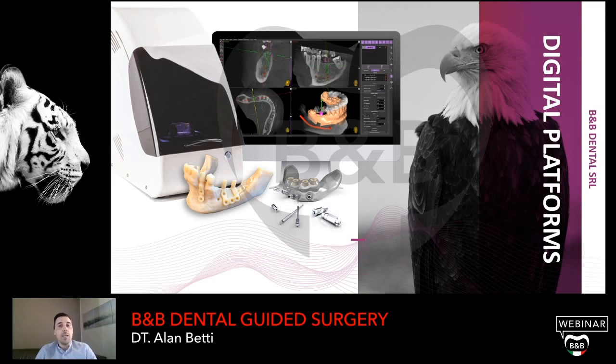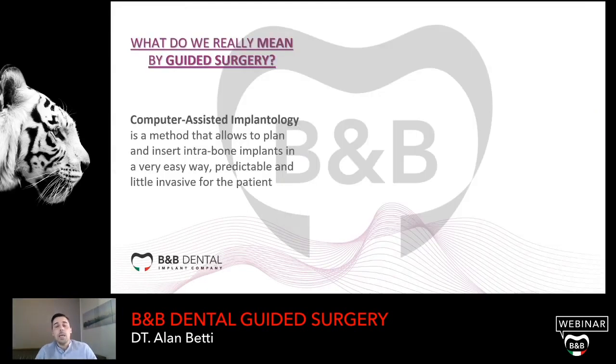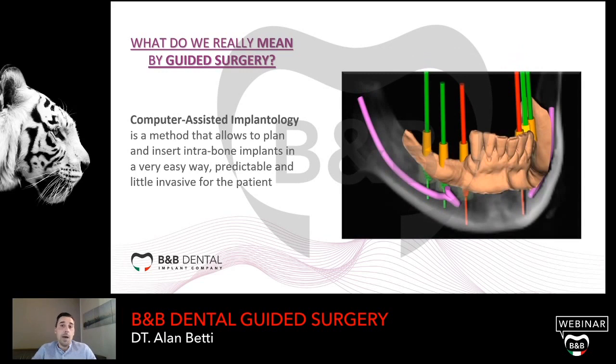Today in this webinar we're going to see all the steps about guided surgery, especially how to take the impressions, which material is used to take an impression, the preparation of the radiological template, implant planning, and the design of the surgical template. Now, I don't know how many of you already use this technique, but I'm sure that all of you have already heard about guided surgery. So we start from the main concept.